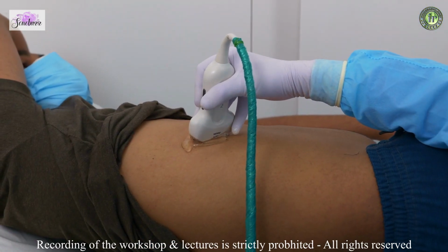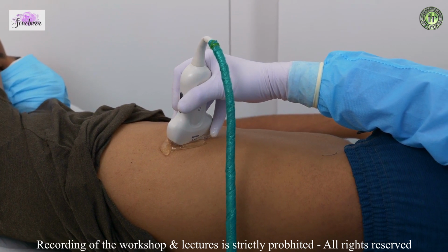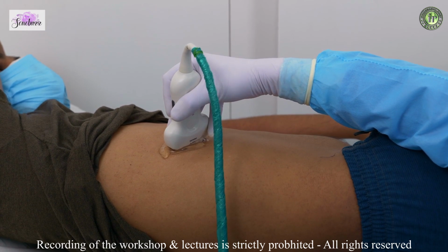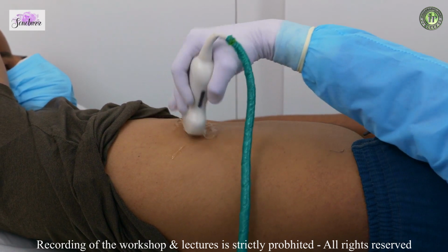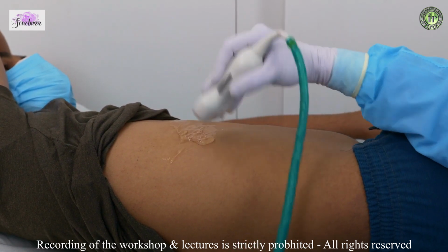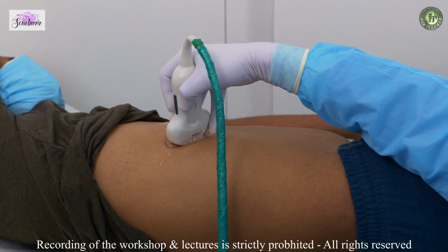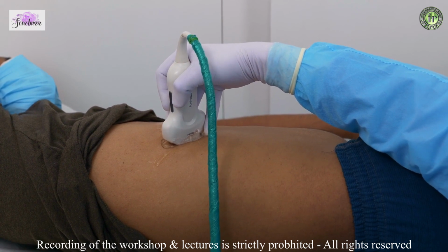So I am telling him to just hold his breath. When I tell him, don't take a deep breath, don't leave out the breath, just hold it there. Okay, stop breathing. Very good. Relax. Okay, release. One of the other things we can do is apply a lot of gel. Again, what this will help us in doing is getting a very good B mode image. You have a very good coupling over here and you get a very good B mode image.